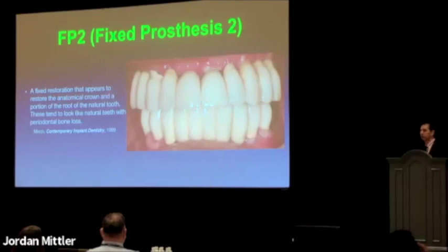And the reality is we use porcelain, and we have technicians who are really good with pink porcelain. But if they avoid pink porcelain, that just makes my life easier. Pink porcelain requires a whole different level of artistry. You can pick a gingival shade from the shade guide, but that's not really what the gingiva has to look like. I'll show you an example next of some really nice pink porcelain work. But it's not easy, and it's not cheap. It's going to add expense.